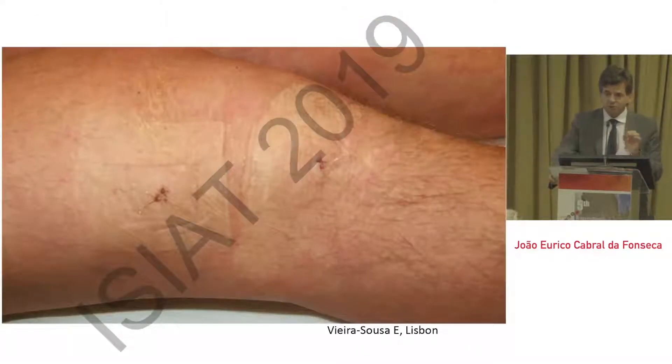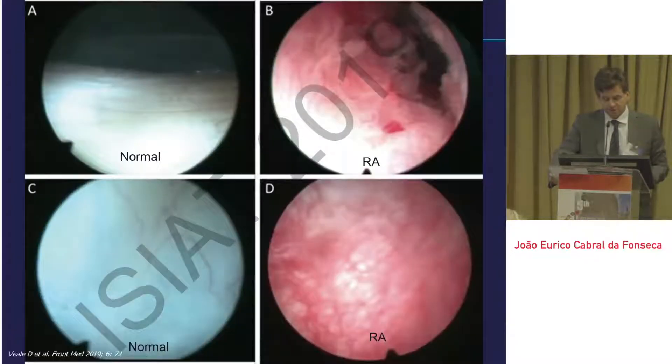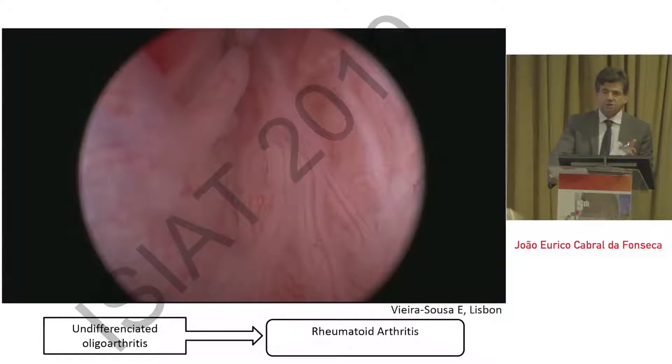Just to show that it is truly minimally invasive — you see here two very tiny holes. The patient goes home the same day. It can give very interesting images, such as the ones shown here. For instance, on the right-hand side of the panel, you see the vascularity of a rheumatoid arthritis patient in comparison with normal synovial tissue. In this case, you see a patient with oligoarthritis still undiagnosed that eventually evolved into rheumatoid arthritis — and you see these very straight vessels that can be observed in patients who evolved into RA.